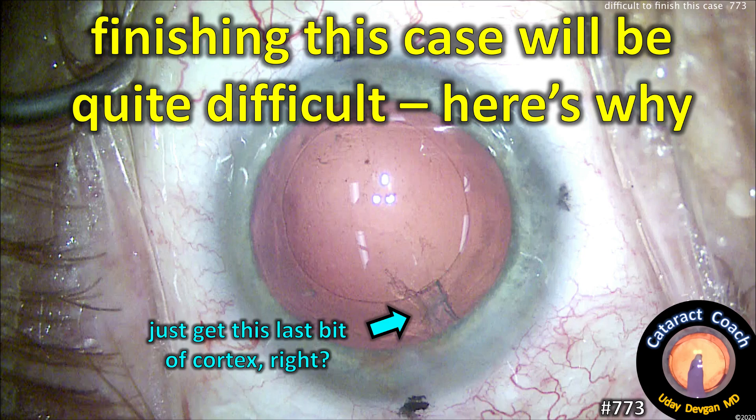CataractCoach.com. Finishing this case will be quite difficult — here's why.